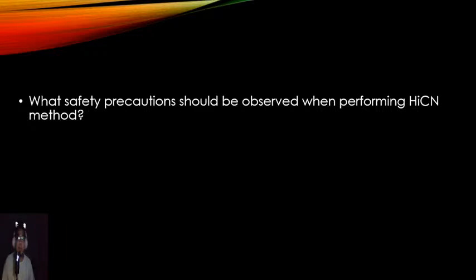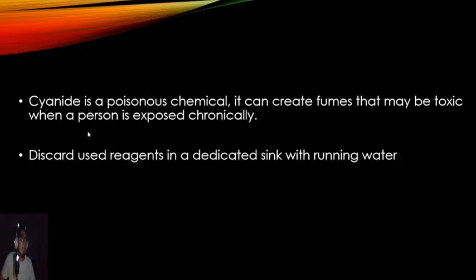Cyanide is, of course, poisonous, and it's a chemical that often creates fumes. All right, and you need to discard your reagents in running water. So cyanide is poisonous, and it can create toxic fumes when a person is exposed to it chronically. All right, chronically. What do I mean by chronically?